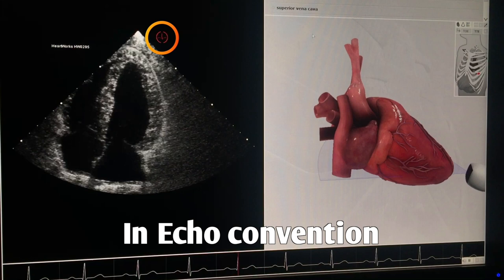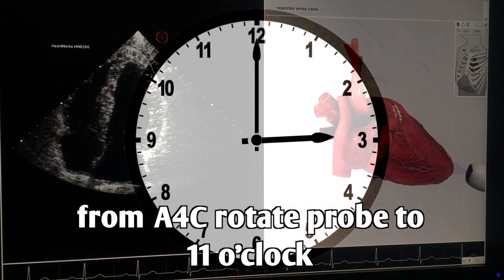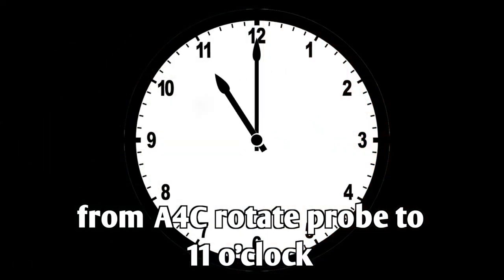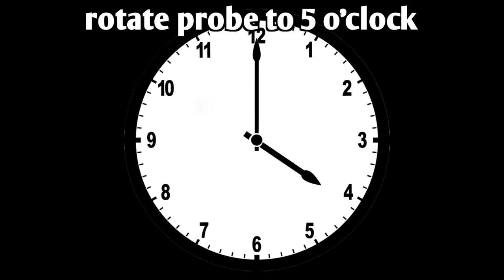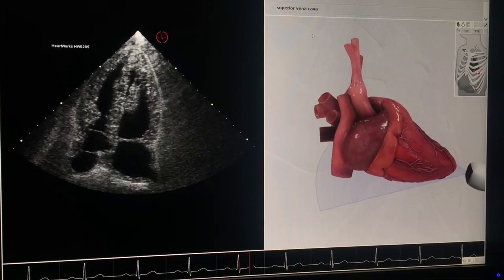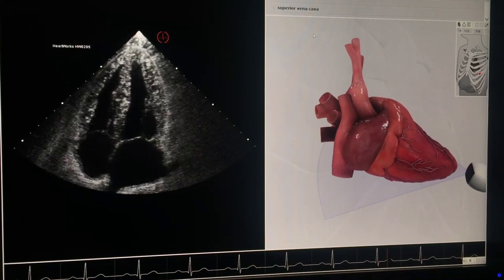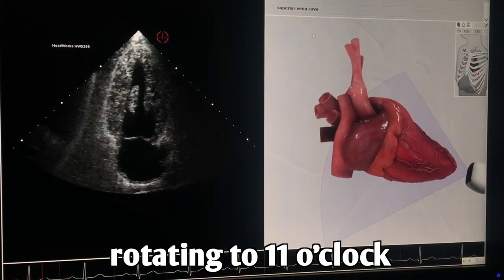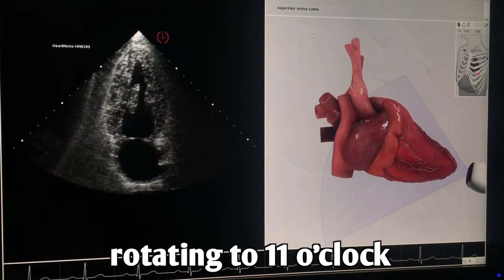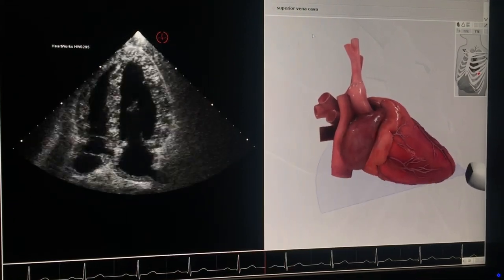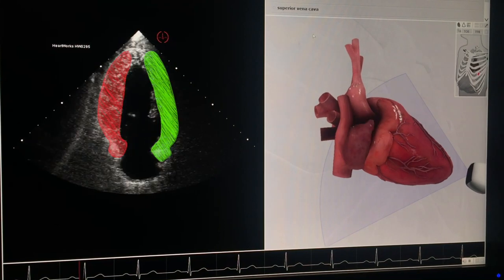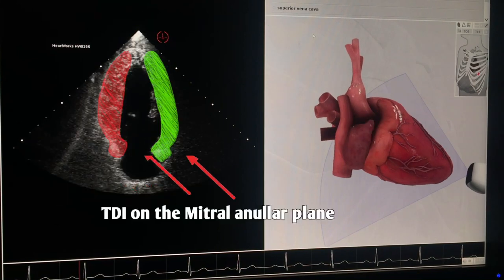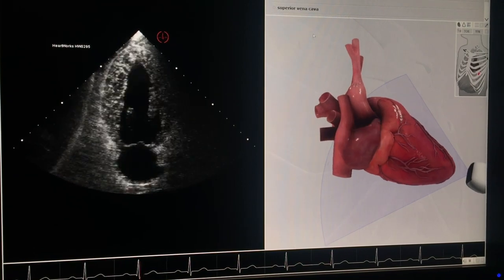From the apical four-chamber view, you can get to the apical two-chamber view. If the probe's marker is on the right side, such as in standard cardiac settings, you will rotate the probe counterclockwise to the 11 o'clock position. If the marker is on the other side, meaning not in cardiac mode, turn the probe counterclockwise to the 5 o'clock position. In the apical two-chamber view, you'll be able to measure the mitral annular velocities of the anterior and inferior left ventricular walls using TDI.